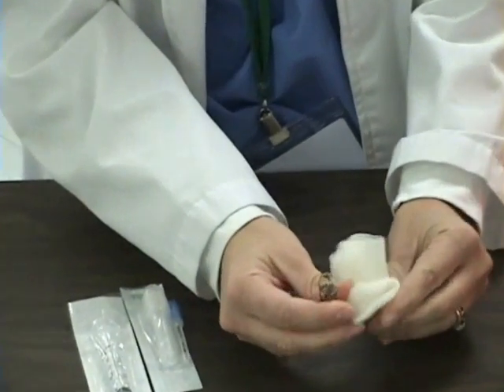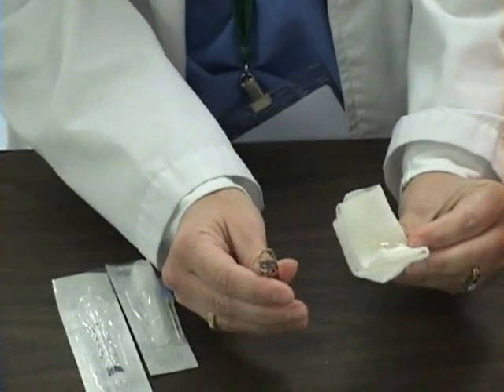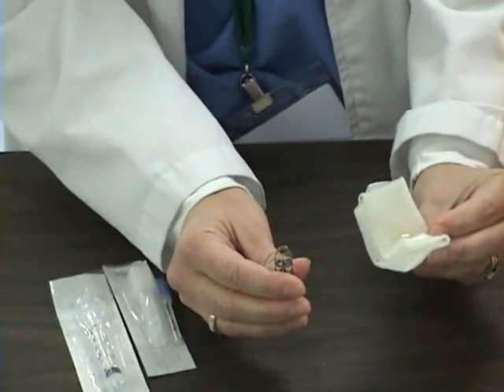At this point, I have the top of the ampoule in my gauze, and it is sharp on the edge, so I will go ahead and put it in my sharps container.